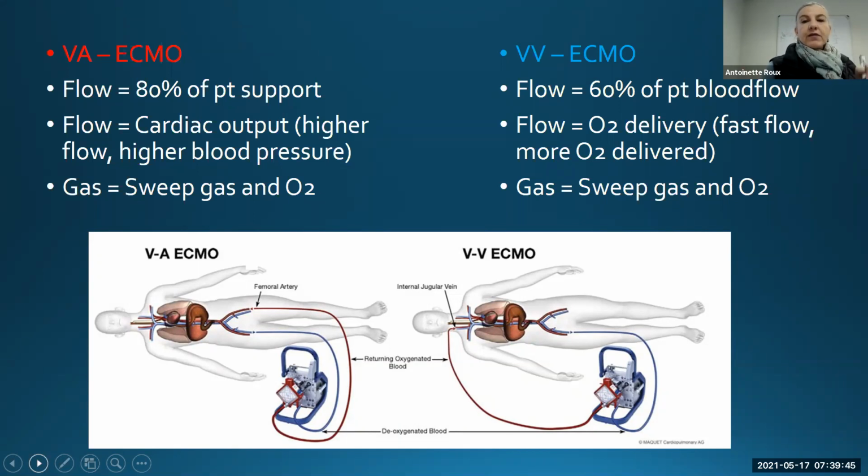But now that can't happen because of either secretions or third space fluid. So when we go into ECMO, we're already in the blood. So we bypass the breathing part, the inhaling part. And then we still take care of the gas with the sweep gas and the oxygen. So we will manipulate those two to get the CO2 within normal limits. Okay.